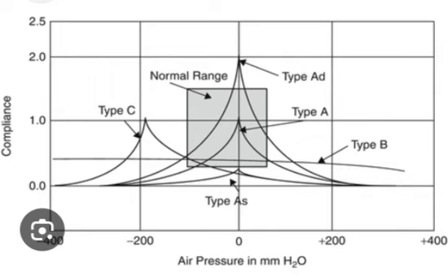The instrument measures the reflected sound and expresses it as an admittance or compliance, plotting the results on a chart known as a tympanogram. Normally, the air pressure in the ear canal is the same as ambient pressure. Also, under normal conditions, the air pressure in the middle ear is approximately the same as ambient pressure, since the Eustachian tube opens periodically to ventilate the middle ear and equalize pressure. In a healthy individual, the maximum sound is transmitted through the middle ear when the ambient air pressure in the ear canal is equal to the pressure in the middle ear.